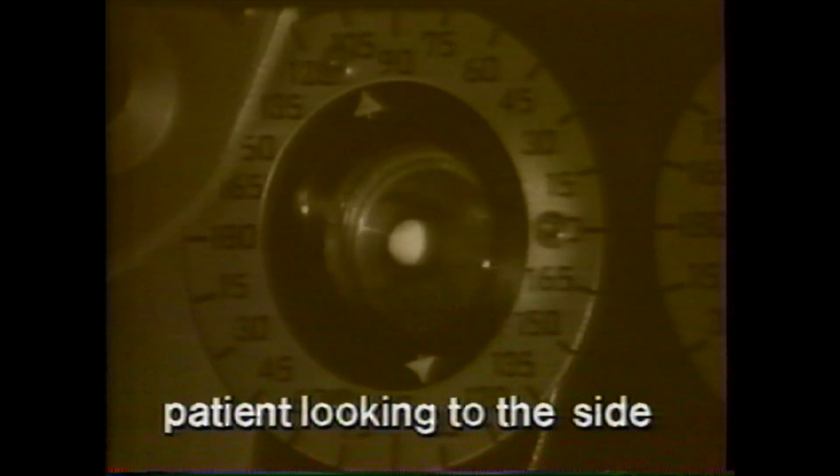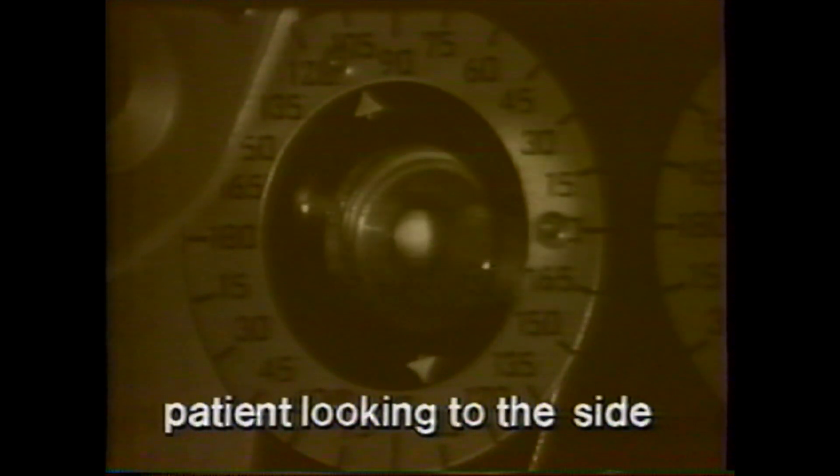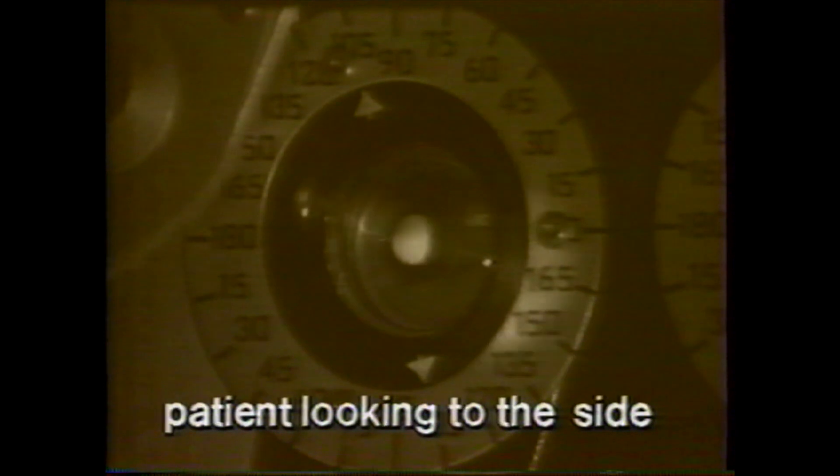In this next patient, we suddenly notice the reflex spontaneously changing, but not from accommodation. Notice that it changes in brightness as well as in its movement. It often becomes whiter as well. The patient is looking off to the side and you are either retinoscoping nasal retina or the optic disc. Redirect his attention to the fixation target at the end of the room. That's better.